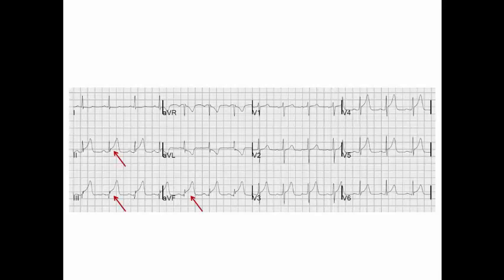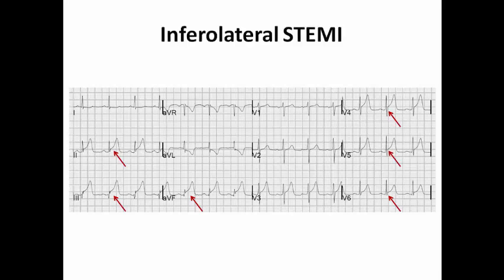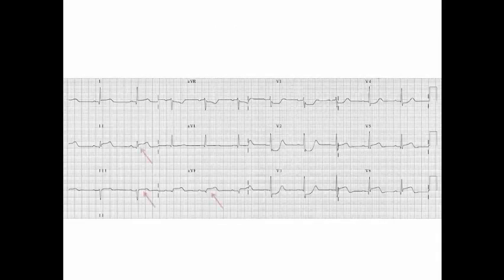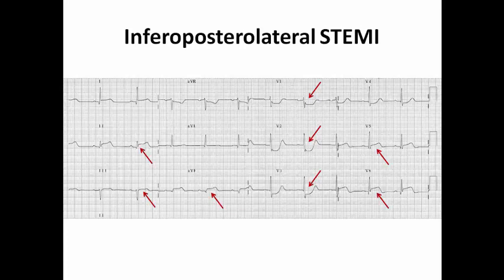In this ECG example, there is ST elevation in the inferior leads. In another ECG, there is ST elevation in inferior leads, ST elevation in lateral leads V5 and V6, and clear criteria of posterior MI with ST depression and dominant R wave in the right precordial leads — this is infero-posterolateral STEMI.